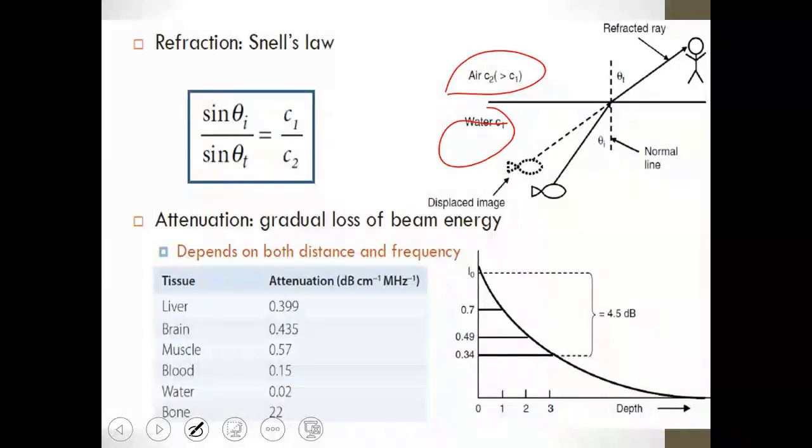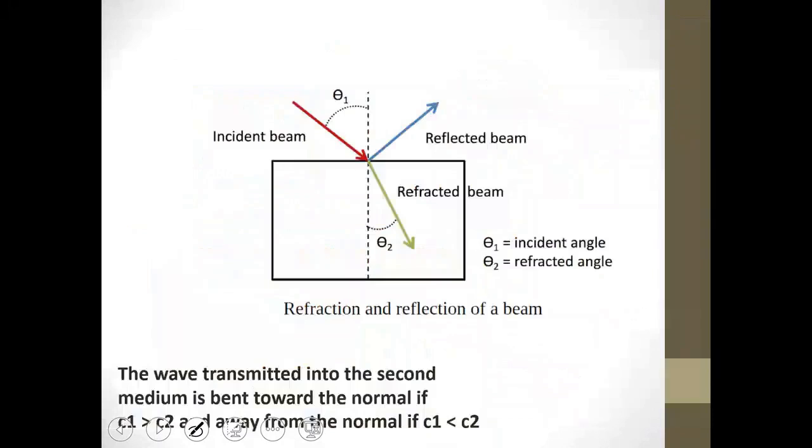It means that when the wave transitions between two mediums that have differences, for example, here is the wave that is coming to you, and it reaches a certain point between these two mediums. Then refraction occurs. It should continue in its path, but instead it experiences this change and starts to move at this angle, which is the refracted angle. This is the incident beam, and this is the incident angle. There is a part that undergoes reflection and a part that undergoes refraction.